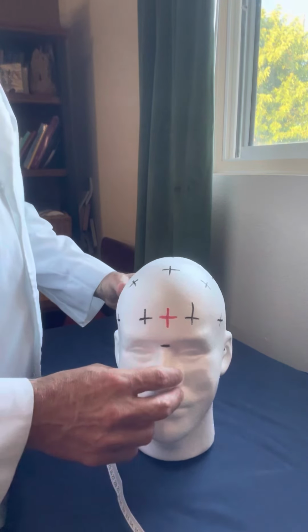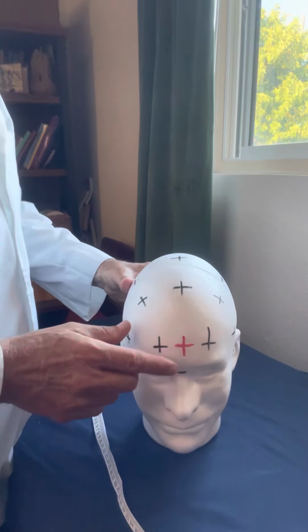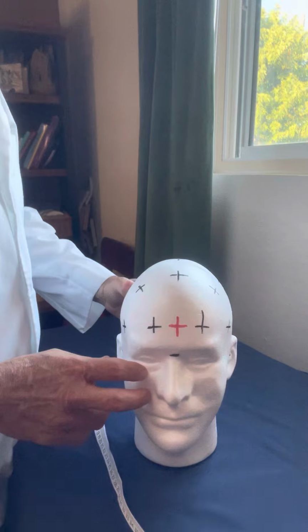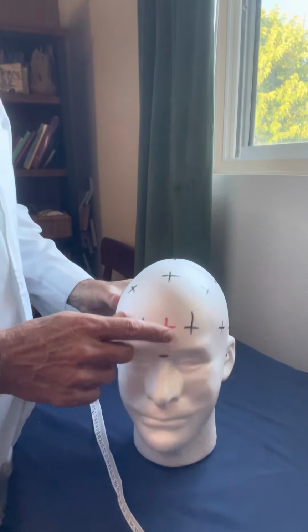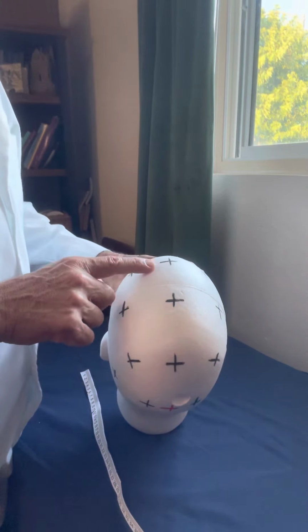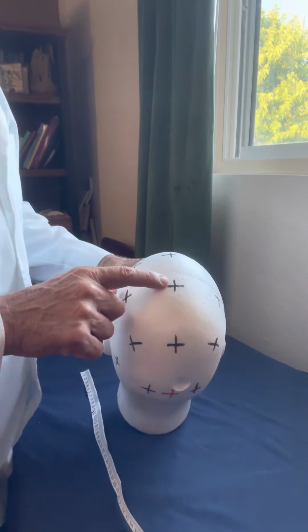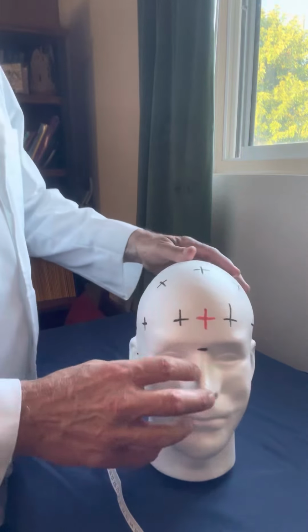All right, students, I want to review with you the distance between each electrode on each plane. Okay, so let's start with the sagittal plane. The three electrodes that we place on the sagittal plane are FZ, CZ, and PZ. Okay, but let's start at the nasion.